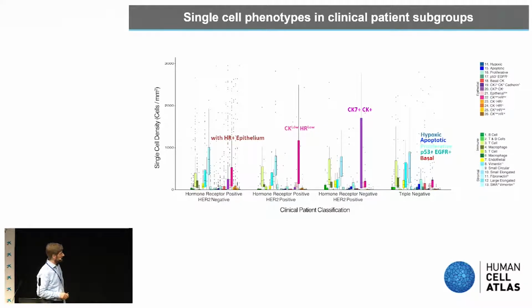Then we started to look at those patients as a typical pathologist would do. So we looked at the luminal A patients, the luminal B, HER2 positive, and triple negative. So these are the 4 categories that are used in the clinics to decide on the treatment of patients. And if we restrict our markers only on those that are used in the clinics, we have a fantastic overlap compared to pathologists. And I don't show you here, but we have a really nice correlation.